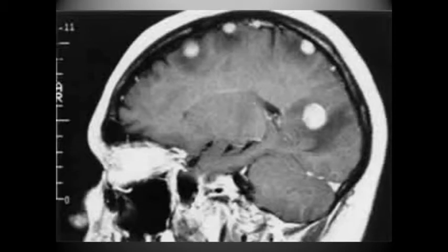On this image, we have brain mets as well. We notice that these areas that I'm circling are portions of the mets, and we have these blackened areas.